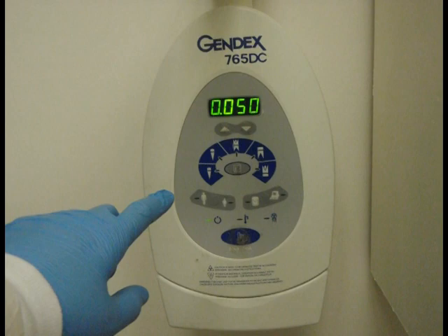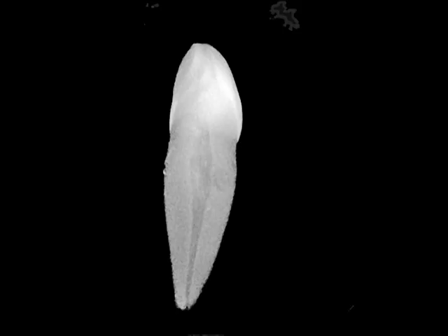We will begin by taking radiographs of the tooth in order to determine the shapes and dimensions of the pulp chamber and canal.